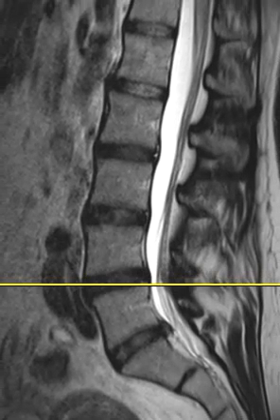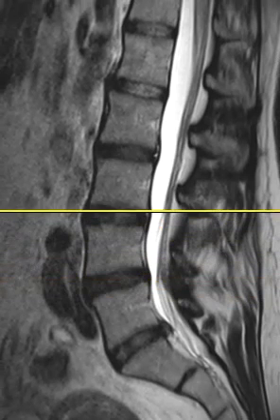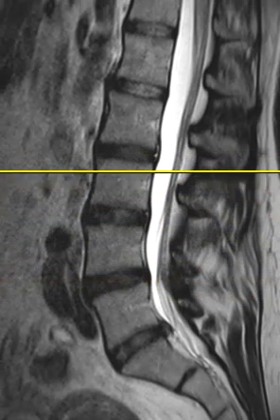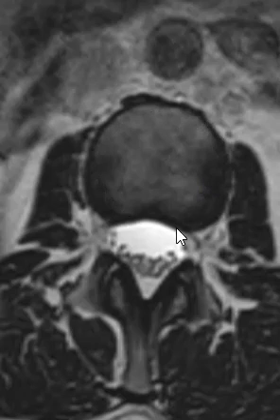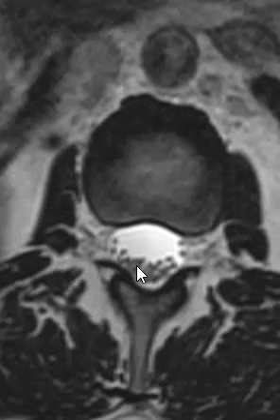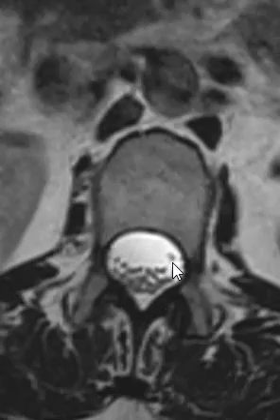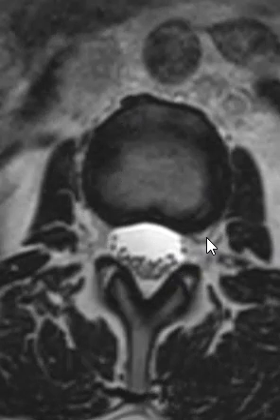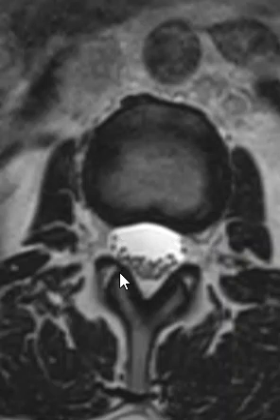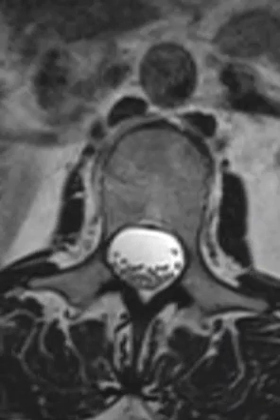Next we perform axial images, slicing through the disc levels. On this axial image through one of the upper discs, the L1-2 level is normal. We see the spinal canal filled with fluid and small dots representing the nerves descending. At the disc level openings, we have a wide-open right foramen and a wide-open left foramen, with a wide-open central canal.